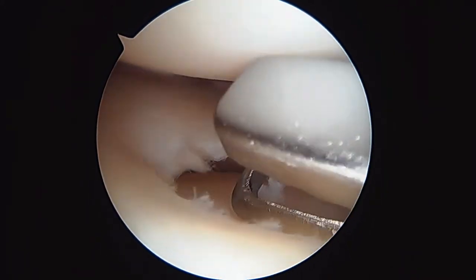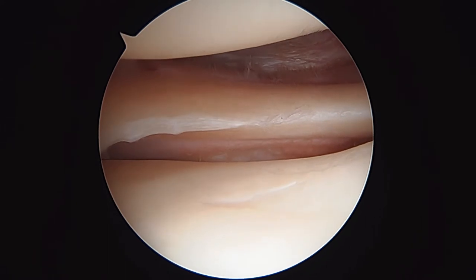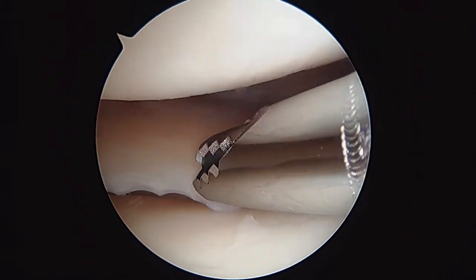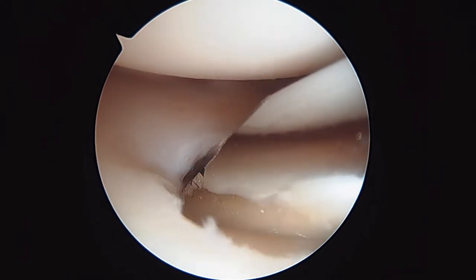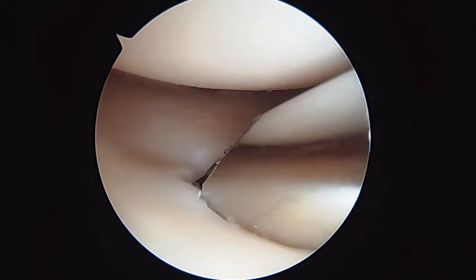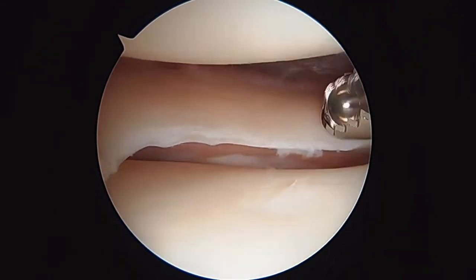Really no more than what you see there. So now I'm going to put the shaver back in because it has suction on it. If there's any loose pieces, we can evacuate those very quickly, as you see. Plus we can polish our little partial resection here, if you will. So that looks really good.